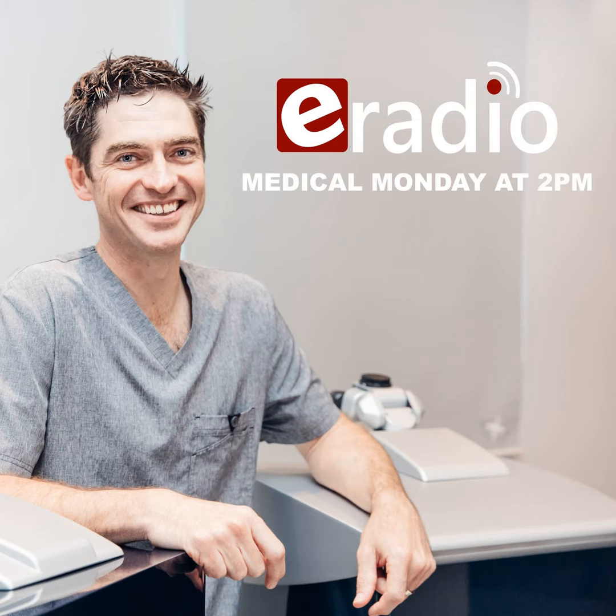And secondly is the visual recovery involved in PRK. Traditionally, it's not a practice builder, so to speak, because it's uncomfortable and because it takes 5 to 6 weeks for your vision to stabilize. But when you look at PRK versus LASIK at 3 and 6 months, the results are exactly the same. Now, going back to the technology that you asked about, the lasers are the area that has changed most dramatically.